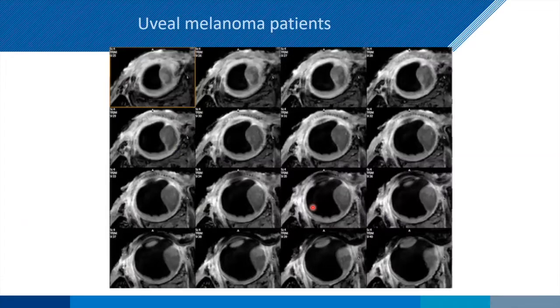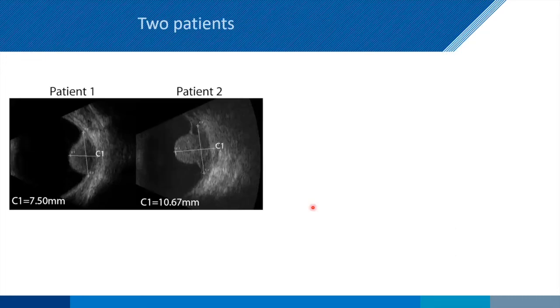And you can see you can then get pretty high resolution 3D images of this tumor that allows you to get very accurate measures of the tumor shape and size. And so if you take these patients, these were a couple of patients, and one of them, clearly 10.7 millimeters, is an enormous tumor that has to come out. What we know though is ultrasound tends to, not in all cases, but tends to overestimate the dimensions.